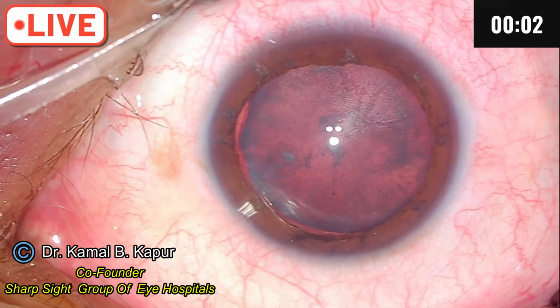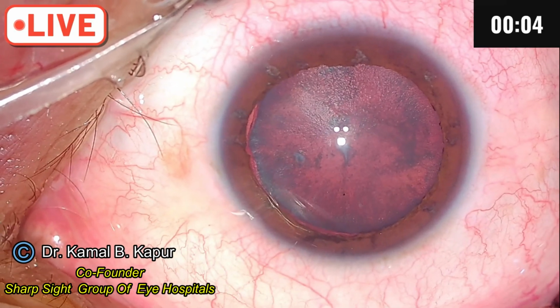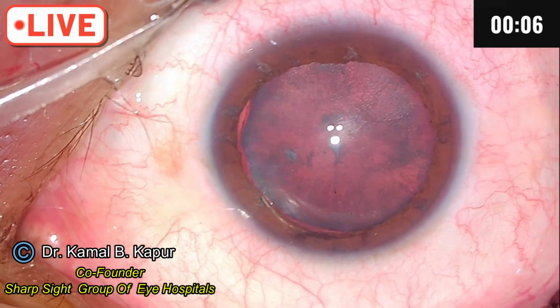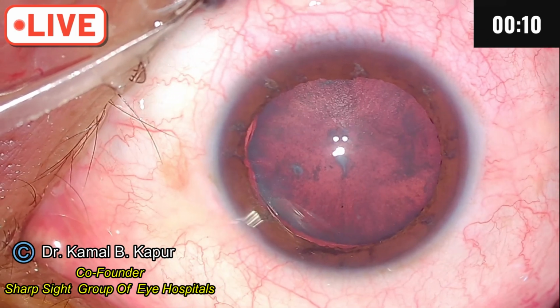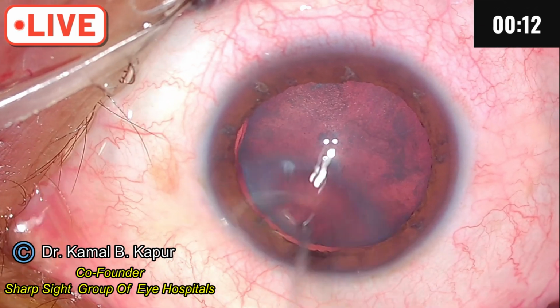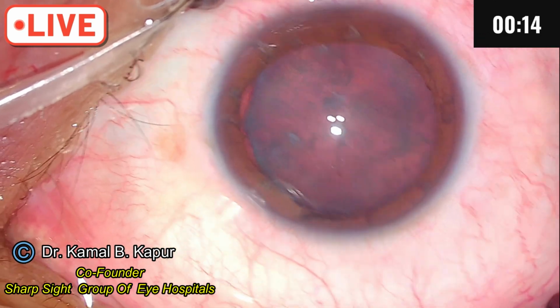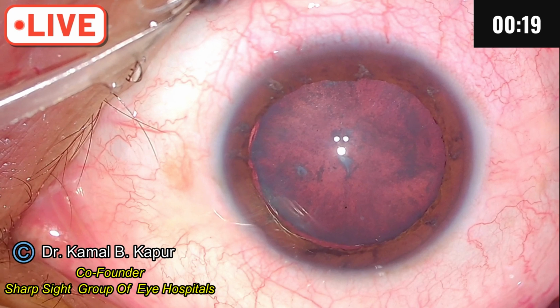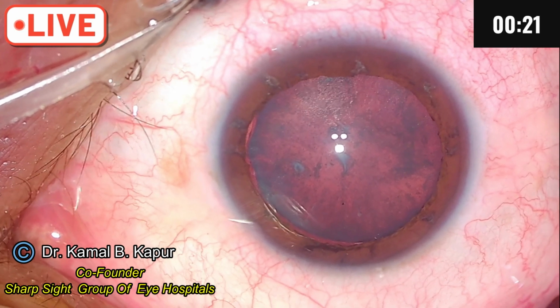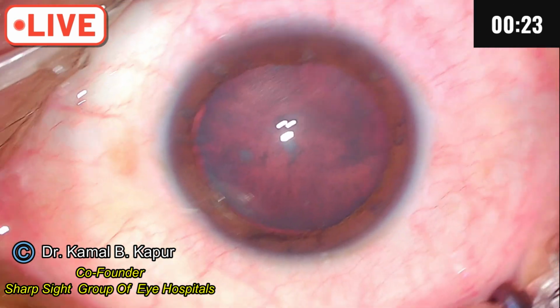Now this is a case of subluxation. This is a post-traumatic case, and you can see the visible subluxation probably is only 60 to 70 degrees, but we will ask the patient to look in different gazes and we shall actually estimate what is the extent of subluxation. So the subluxation in traumatic cataracts is actually non-progressive, so they are a little bit more forgiving.